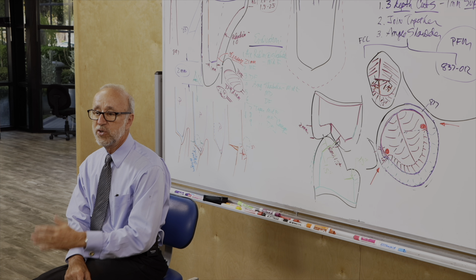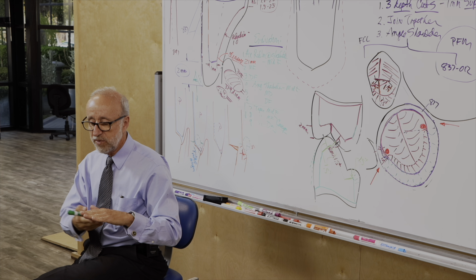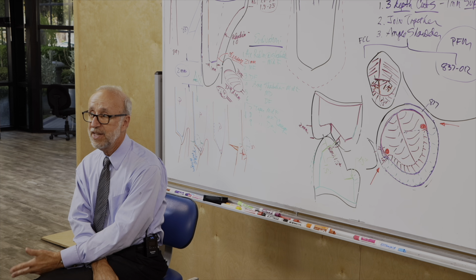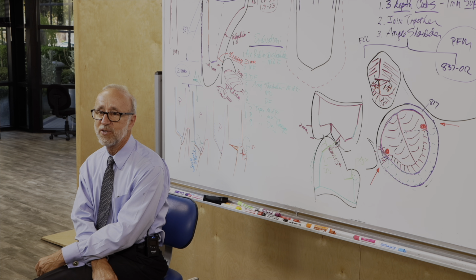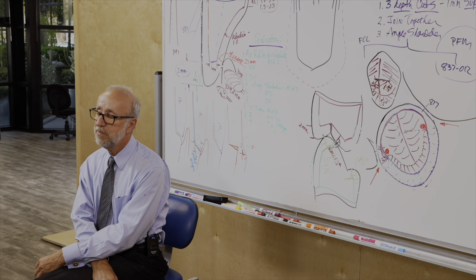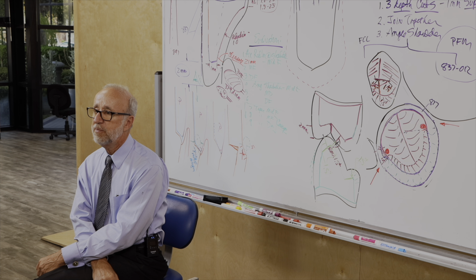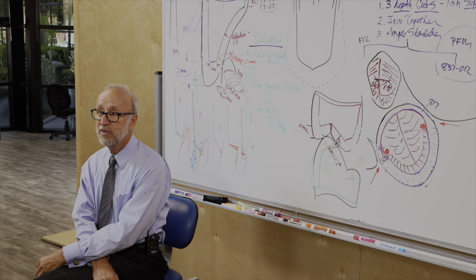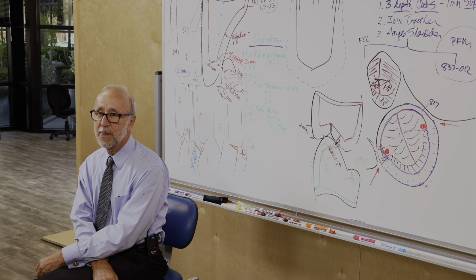Okay? If you're doing a groove and a flare and you have a step at the bottom of the groove, if you don't make the smooth connection between the chamfer and the bottom of the flare, then it's probably going to last 10 years. If you did make that smooth connection, it will probably last 30 years. Okay? Those are things to be paying some attention to. Again, if you are looking to do the very best dentistry that can be done for your patient, then that's the level at which you have to be concerned, and that's the level of knowledge that you have to have as far as what to look for and what you have to see. Okay?